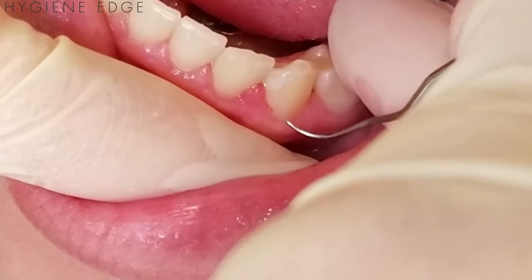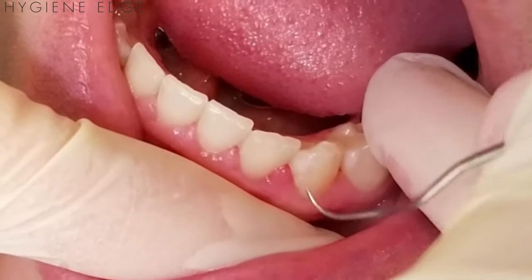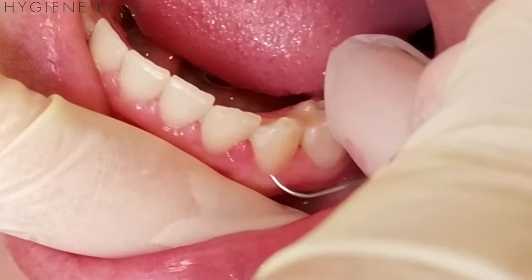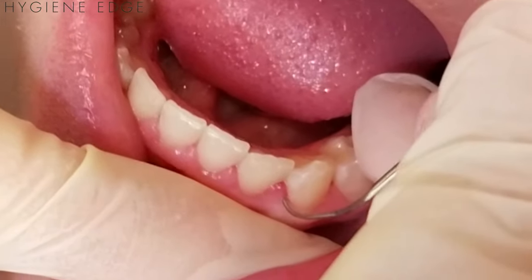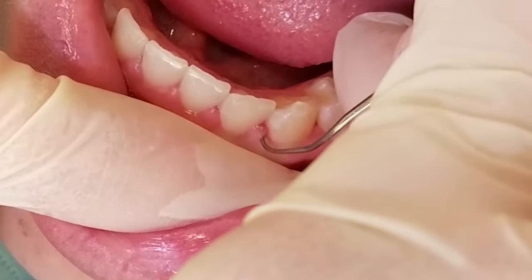One of the things I see students do is they explore like this and just follow that gingival margin up. But remember, you've probed — I know that this probe depth is three millimeters. So I need to make sure that at the line angle I'm going down three millimeters to feel for that calculus stuck up in there.